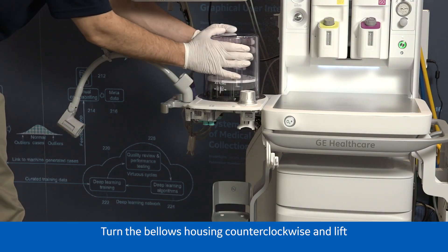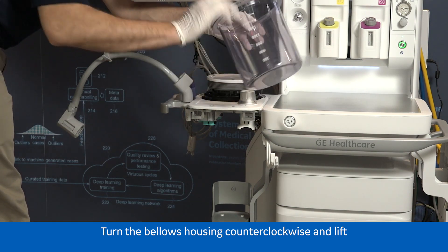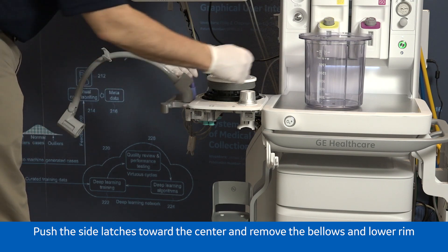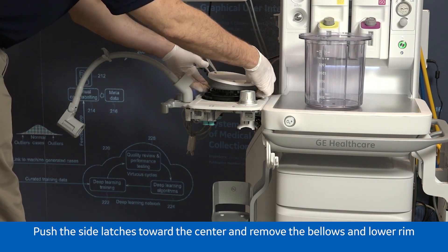Turn the bellows housing counterclockwise and lift. Push the side latches toward the center and remove the bellows and lower rim.